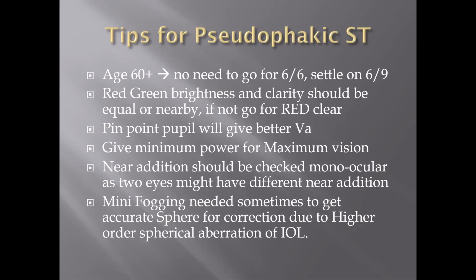Then you have to check the vision on red green. The brightness and the clarity on red and green should be equal or nearby. If the patient is not getting equal clarity on red and green, then you have to go for red clear.